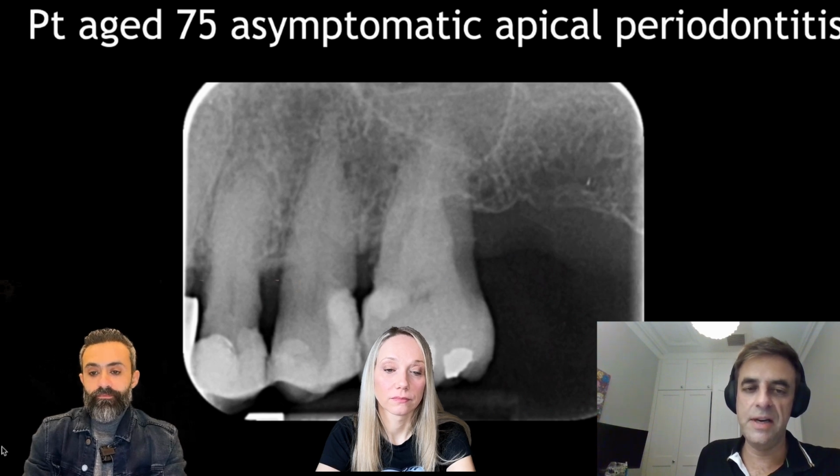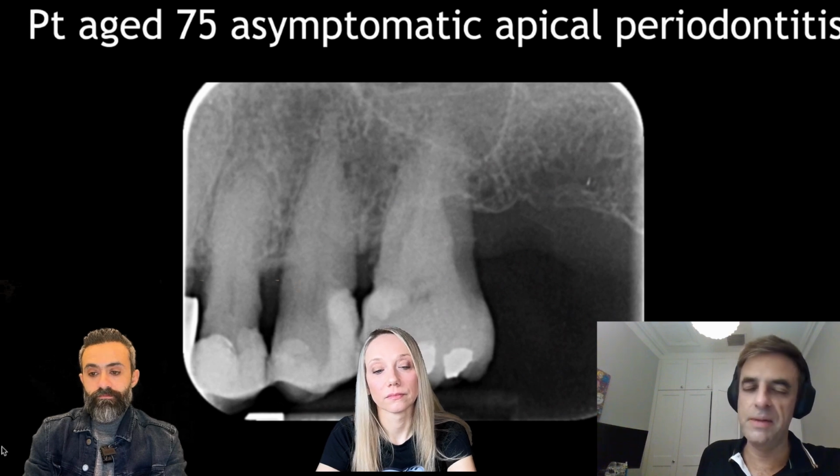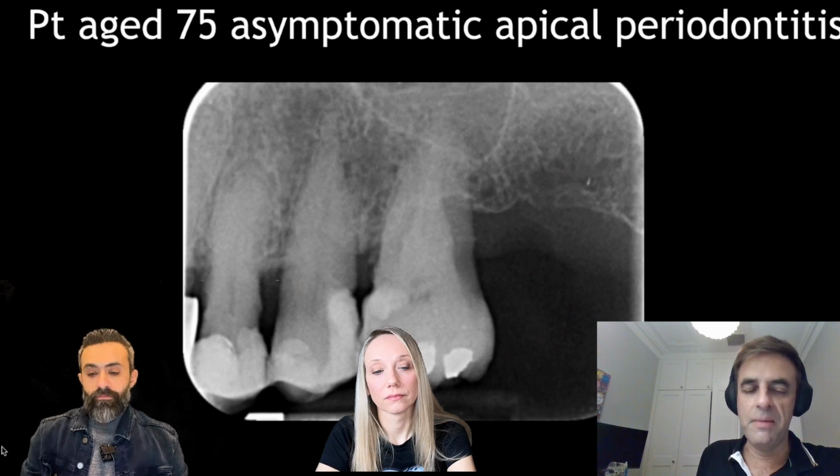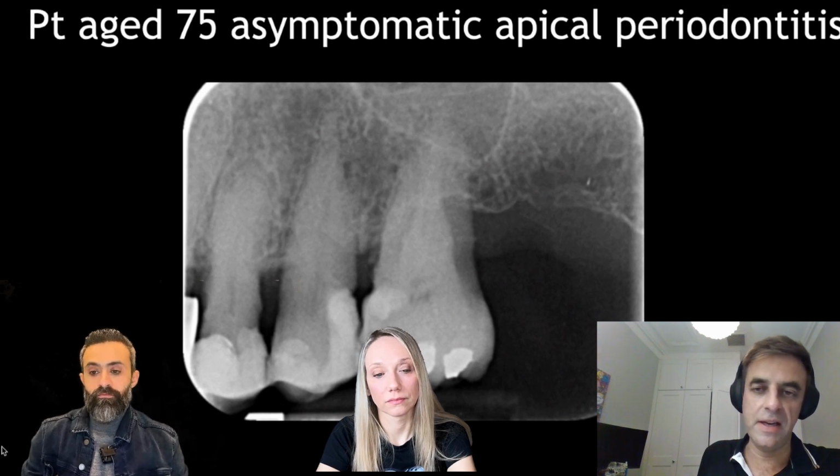So that's when 2D radiography becomes something that I'll definitely do as well as the CBCT. But I tend to do one or the other if possible rather than both. But there are times that you should take both to check out the restorative margin. If I have a good radiograph from the dentist and they haven't started root canal treatment already, because they could have had a complication during that treatment, then I'm happy to go with just the CBCT and use that. Otherwise, I will take this.